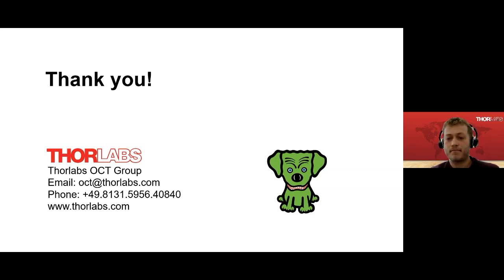Okay, thank you. Benedict and an anonymous attendee asked why common path is less used in swept source OCT. Sebastian, do you want to answer this one? Yes, thank you for the question. It is basically because we cannot easily realize that with balanced detection.